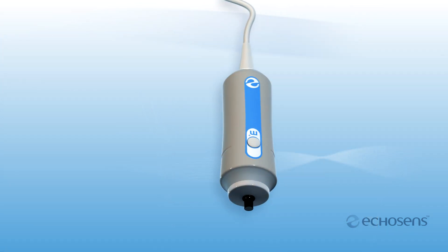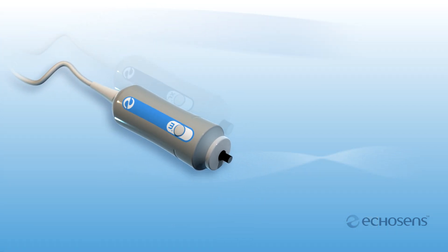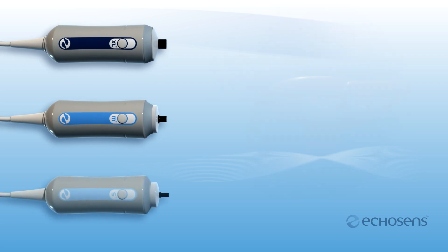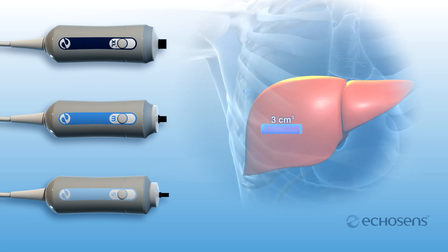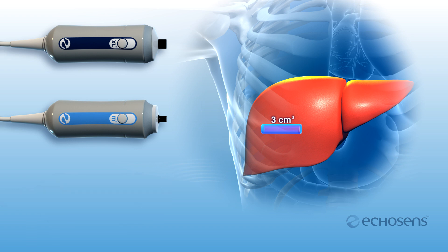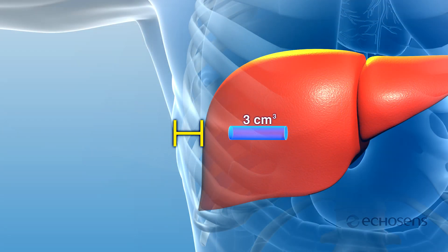To accomplish this, FibroScan is equipped with three probes: two for adults and a pediatric probe, each designed to address different patient morphologies. FibroScan offers two adult probe models that accommodate the varying distances from the skin to the center of the liver in adult patients, which we call skin to capsule distance.